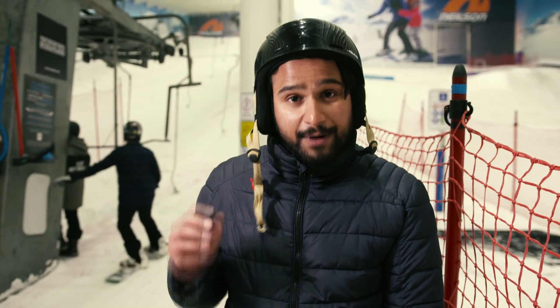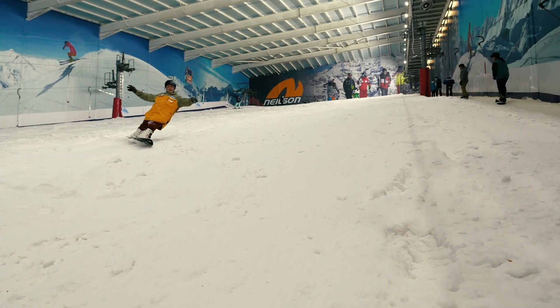It may be mild weather outside, but Darren's training requires him to practise in minus two degrees. Today is an important session — it's the first day he'll be using his new binding, which will hopefully make all the difference.